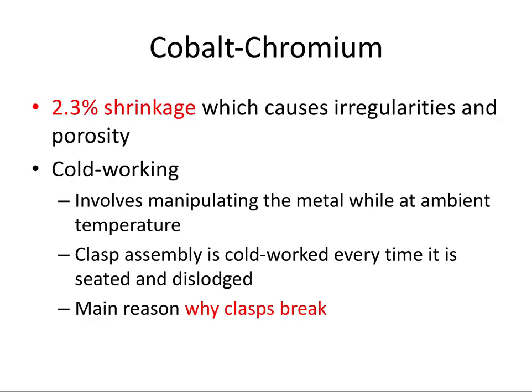And this is why the clasps break. It's the main reason why clasps break, because of cold working. And that could definitely be a question on the board exam, so I would definitely remember that one. And cobalt chromium, again, is a good framework material, but it does come with some shortcomings, particularly in terms of the clasps breaking.